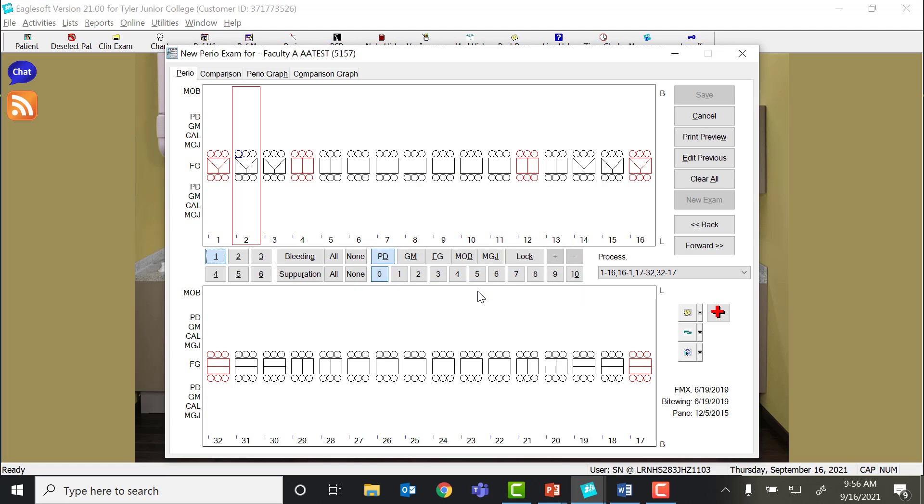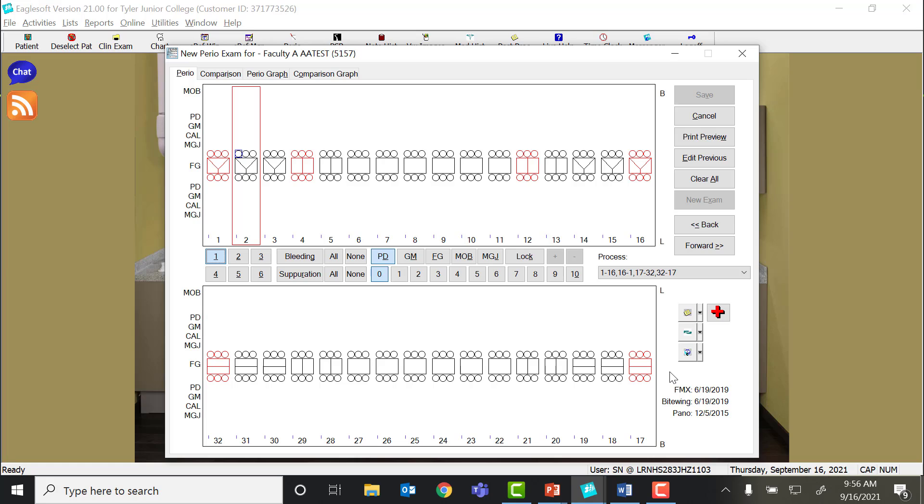You'll notice once I open the perio chart, all the teeth that I have marked missing are now red, and so Eaglesoft will automatically skip over these teeth. If you accidentally forget to remove the teeth first, then Eaglesoft is going to default and start with a distal buccal of number one, as it assumes that this patient has all 32 teeth. So be very mindful about making sure that you remove all the missing teeth first, or you could get completely off on your probe chart.